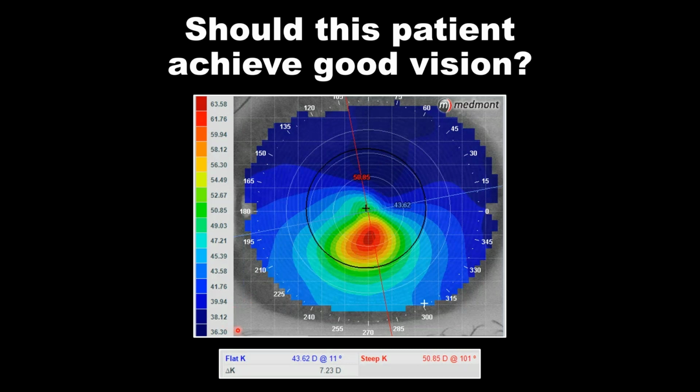So that's about a 27 diopter distribution of power between this point here and this point here. There are specialty soft lenses to manage keratoconic patients, but can they manage that kind of power distribution within the pupil? I'd be suspect that there'd be any hope of that happening. Really this is a patient best served with rigid lens optics.